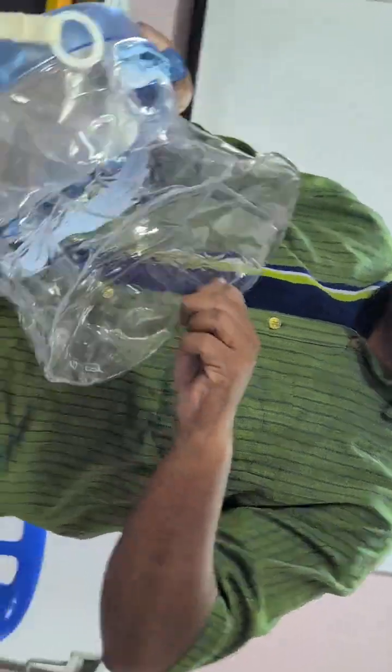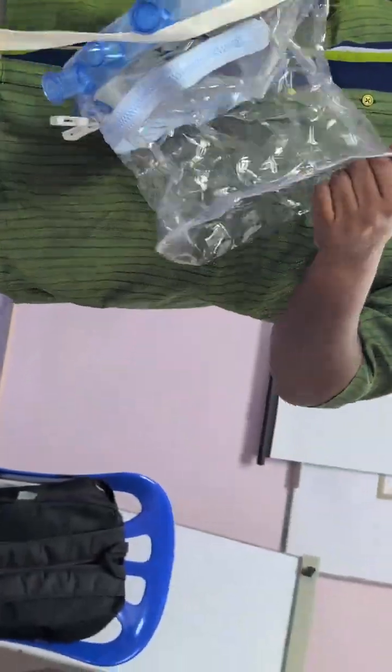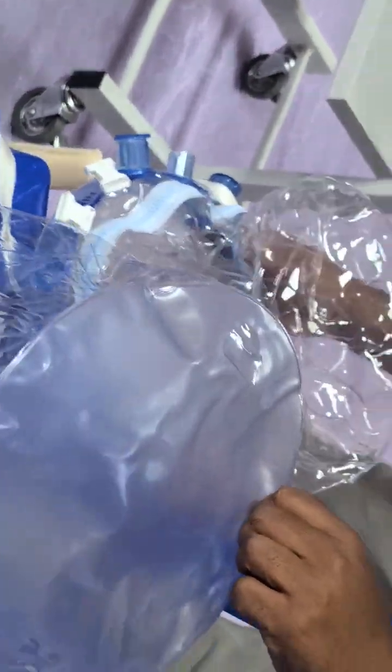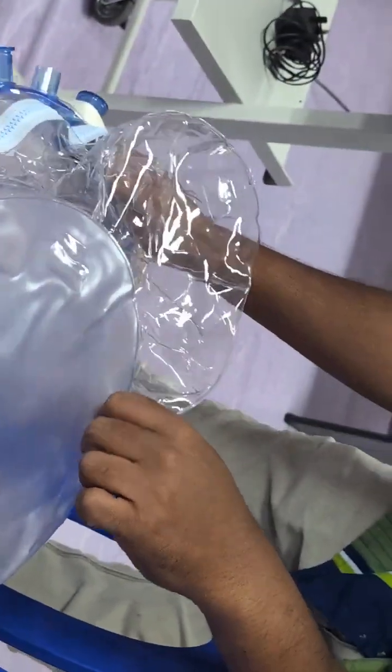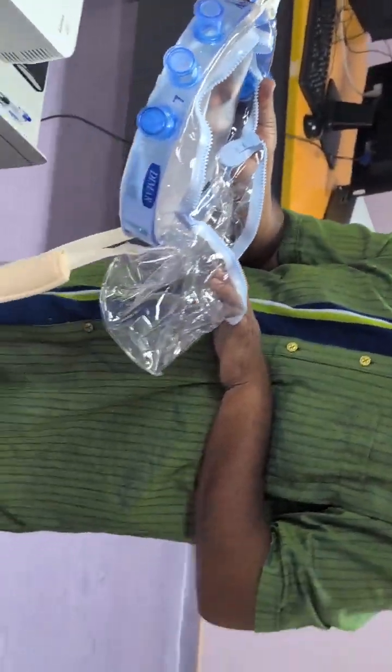Now this one is a little bit different. You see the dead space? Small, right? Very cute. And to put it on, open the top first.